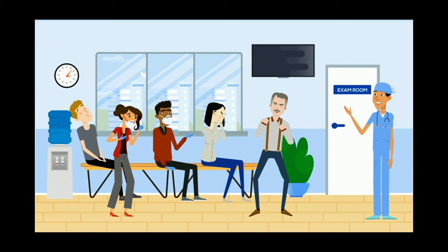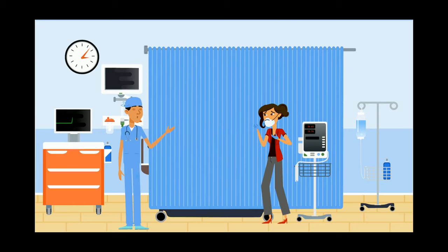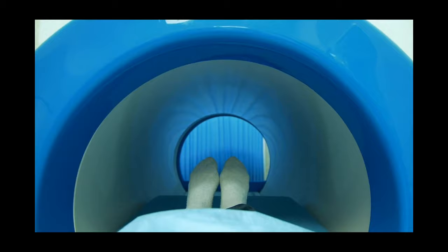The waiting room is crowded with happy patients like every day on your routine. You have four different patients presenting with cough, fever and shortness of breath. After examining your patients, you have decided to include COVID-19 on your differential diagnosis. Then you ask a chest CT for all of them.